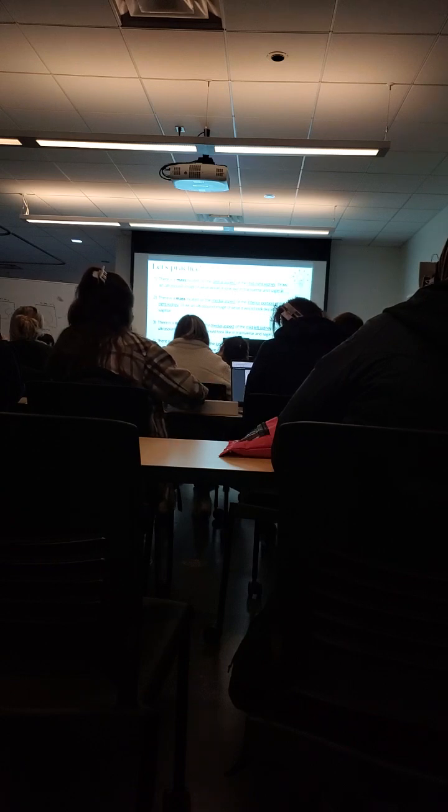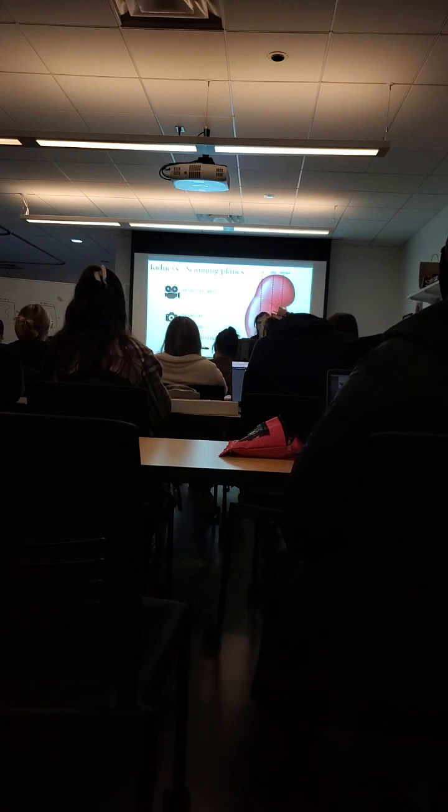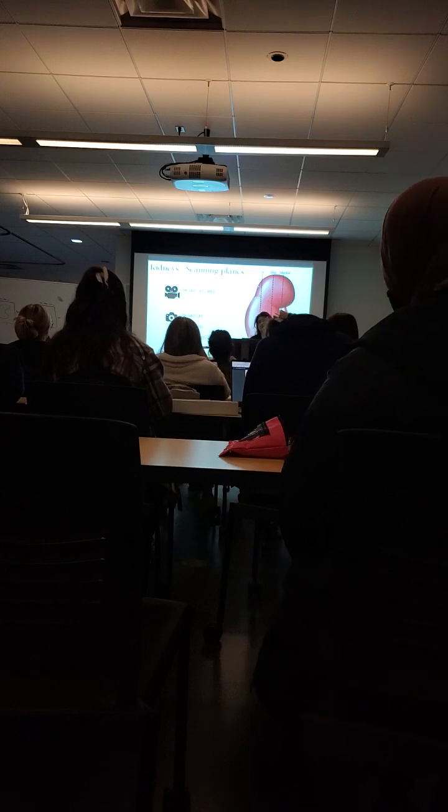Don't worry, I expect you to be confused. This is why I did this for you. Right here. So the 3 images you're gonna take: the top one is gonna be a slice of the lateral, and then the mid is gonna be just a slice of the mid. And then you take a slice of the medial. Even though it says it was in the mid, we know that the lateral aspect is where the mass is. And so we have to show the representation of the lateral. Does that make any sense?